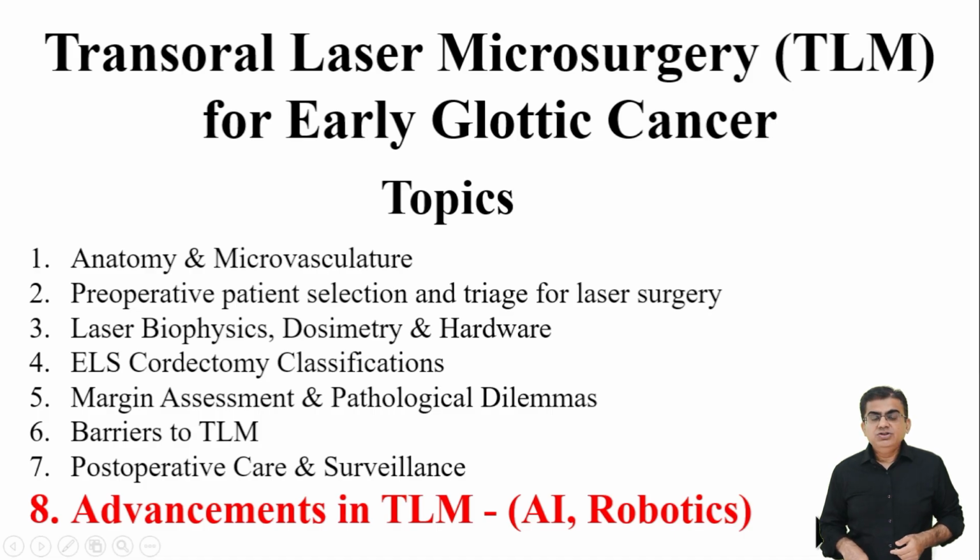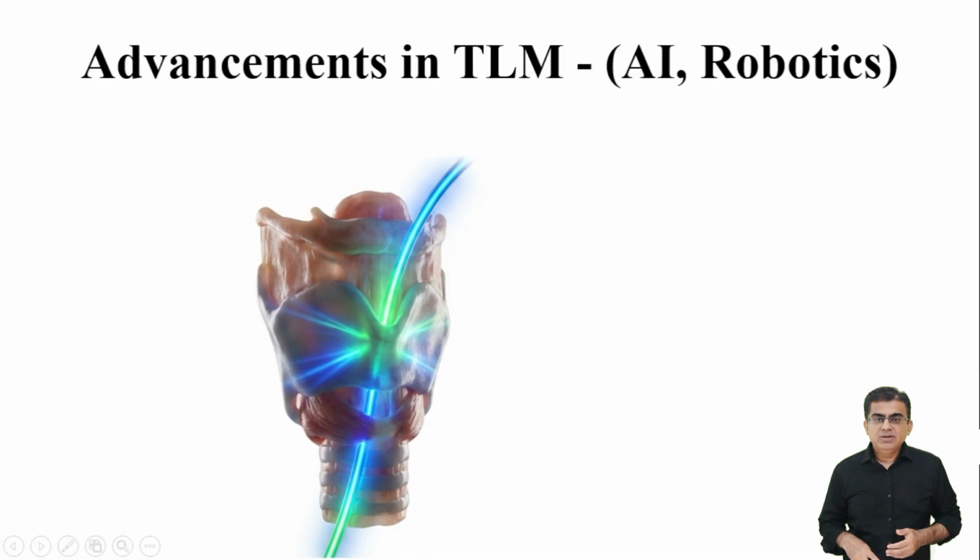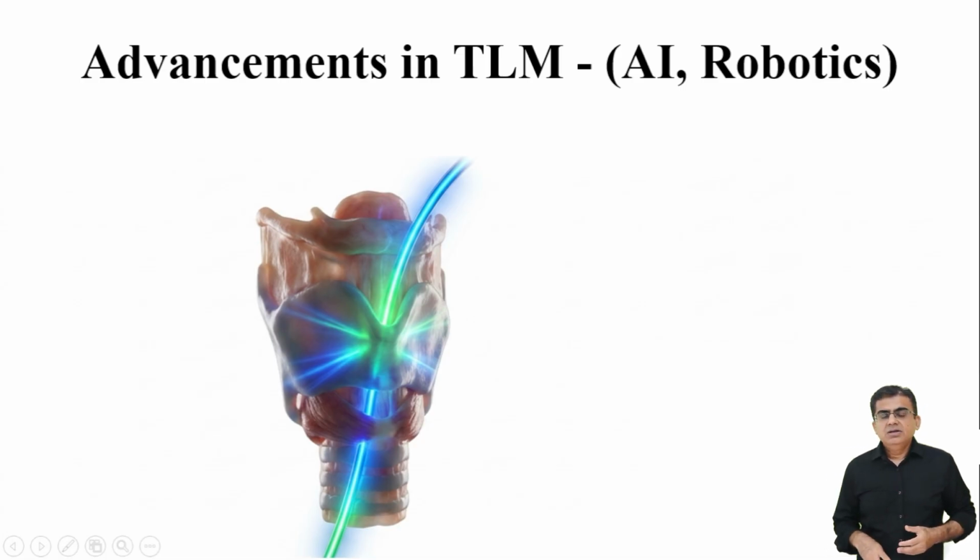Our next topic is the future of laryngeal oncology. We are going to see what advancements are happening in TLM. We have spent a lot of time discussing the current gold standard of transoral laser microsurgery. But we also honestly know that our current standard has major physical limits. We constantly struggle with difficult patient anatomy and straight line of sight barriers. We also struggle with making perfect margin assessment because of the thermal heat damage.